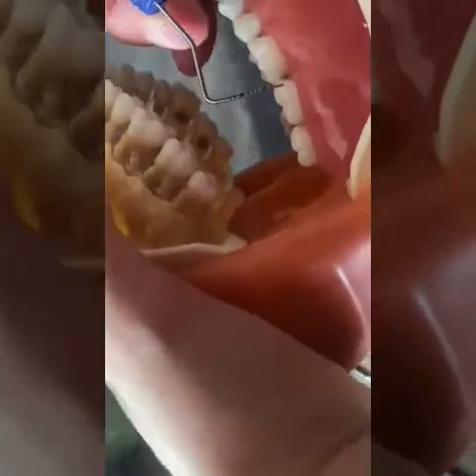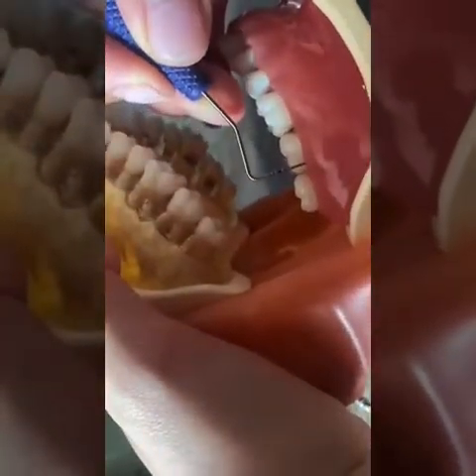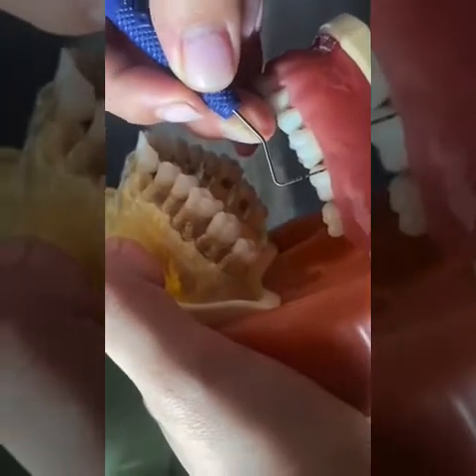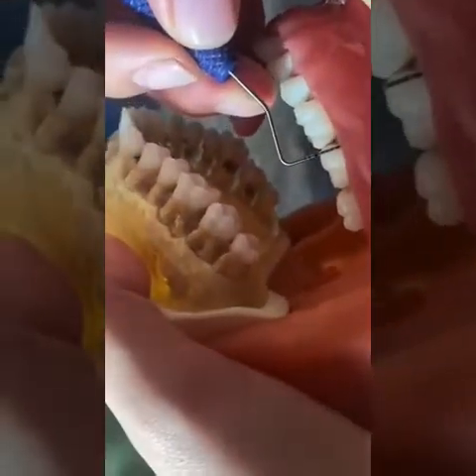And then we record our deepest measurement, then we remove the instrument, and then we start at the distal line angle and make sure the working end is parallel to the tooth. And then we're going to walk the instrument to the mesial line angle, record that number, and that number is going to be the facial, so that's our second number.